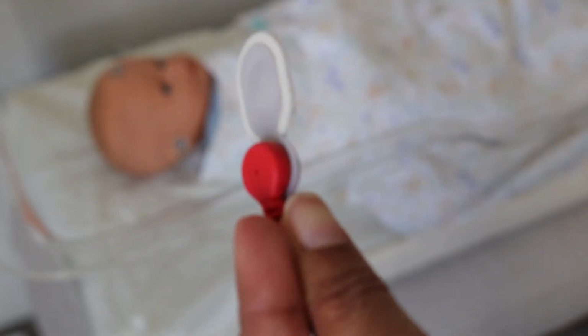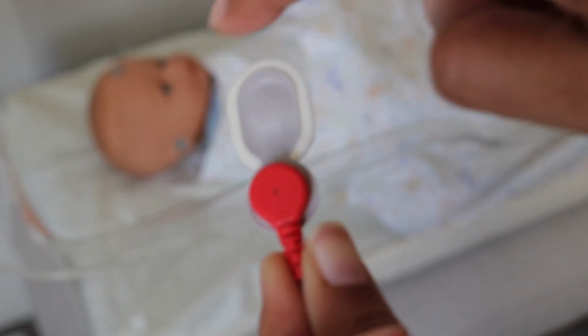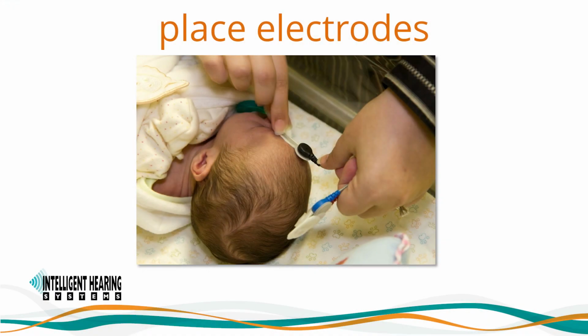Press down around the sponge to secure the electrode in place. Do not press in the center of the electrode, as this can spread the gel and make the electrode come loose. You'll save that for when you're removing the electrode at the end of the test.